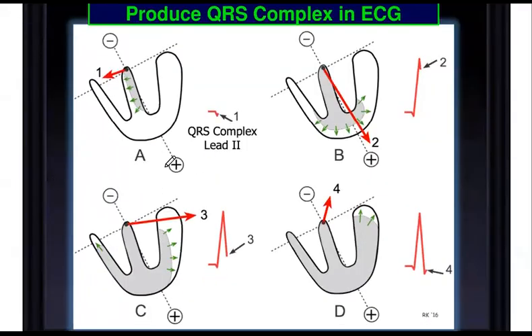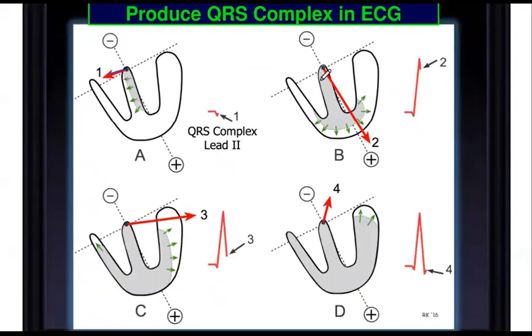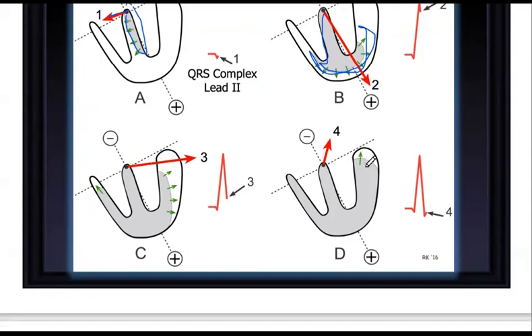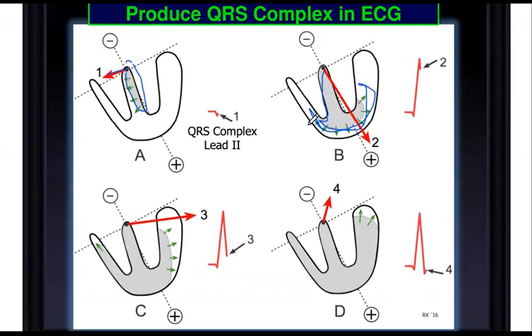You can see here the first step, and second step, how the QRS complex is coming. It is the beginning of contraction of the ventricle, and contraction begins and completes 50%. Then again, at the peak level, the complete contraction is happening, and at the end level the contraction has happened. So this is the QRS complex. Understood here?